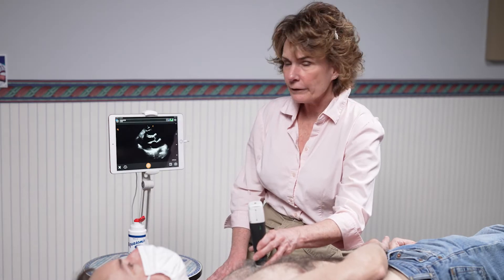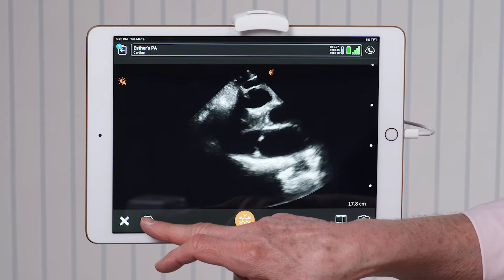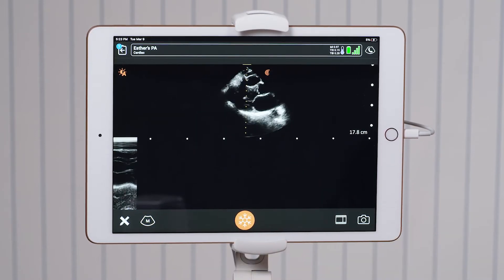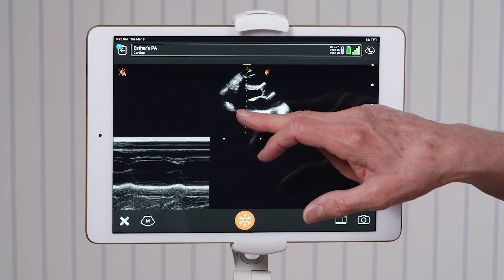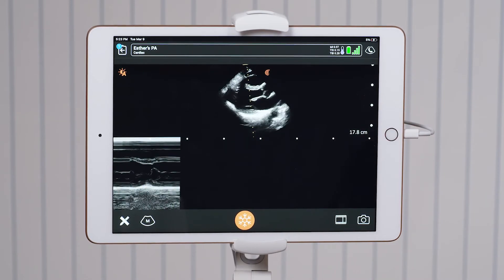Once I have obtained that view, I press the mode icon at the bottom left hand side of the screen. I select M mode and I put it at the tips of the mitral valve for the best measurement.